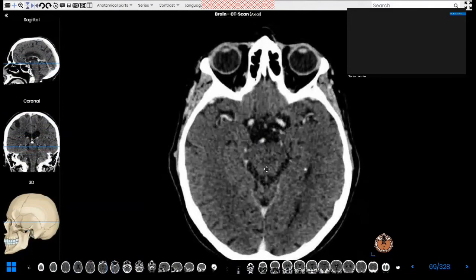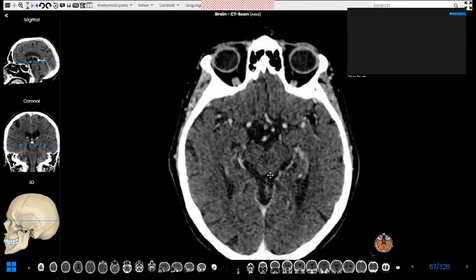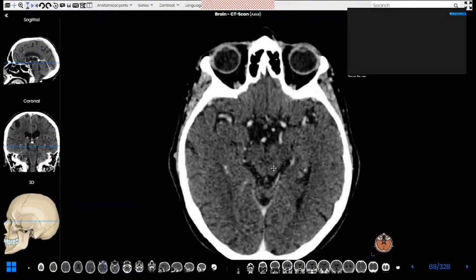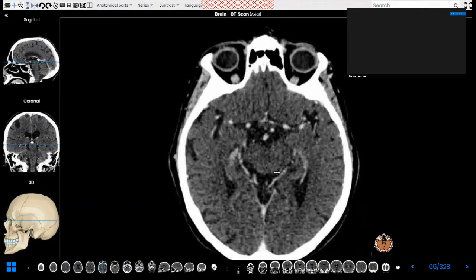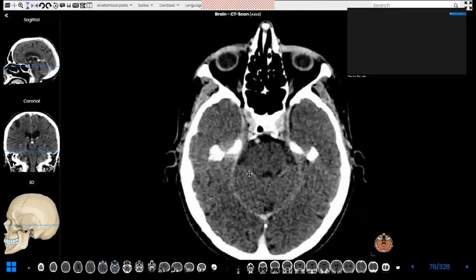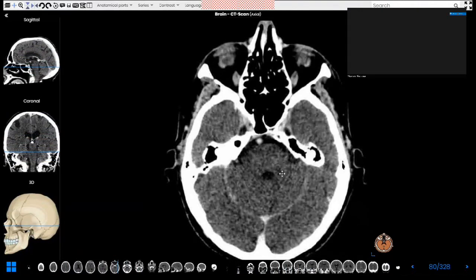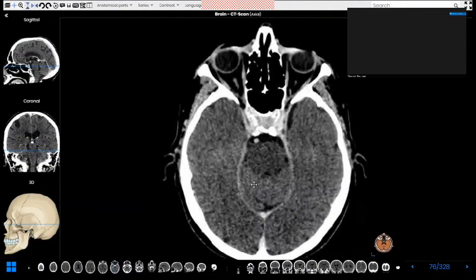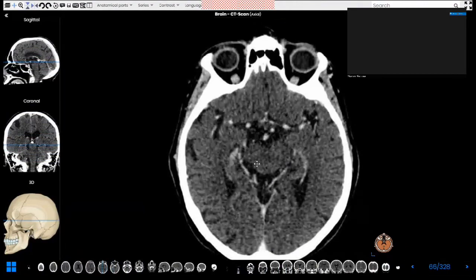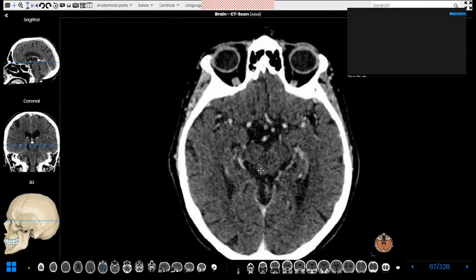Now we come to the brainstem. This structure is the upper aspect of the brainstem and is called the midbrain — it looks like Mickey Mouse. The Mickey Mouse ears represent the cerebral peduncles, which connect the midbrain to the cerebral hemispheres. When we scroll down, this structure is called the pons, and it is connected to the cerebellar hemispheres by the middle cerebellar peduncles.